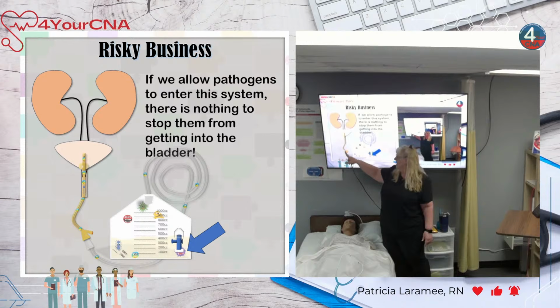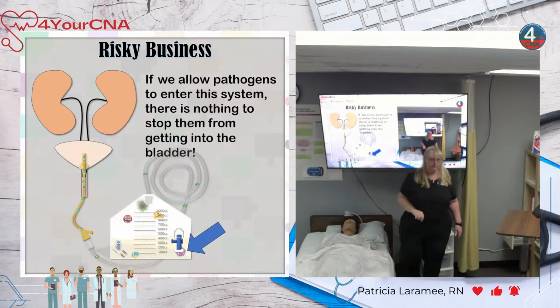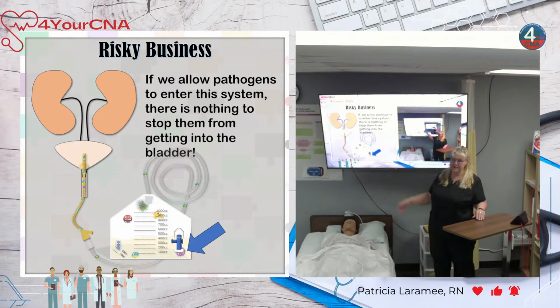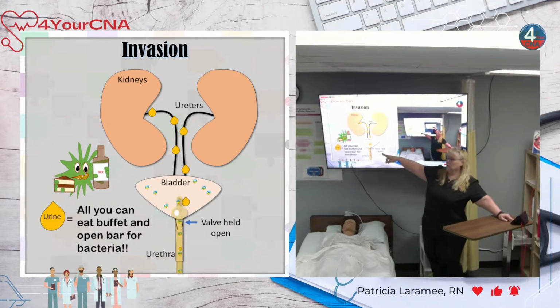If you let bacteria into this catheter during that change, this is a day trip, guys. Day trip. No big deal. They'll do that all day long to get to the prize at the end of the tunnel. Got it? So remember, the name of the game here is to not let bacteria in at all, because we know that this is the ideal environment for those bacteria.